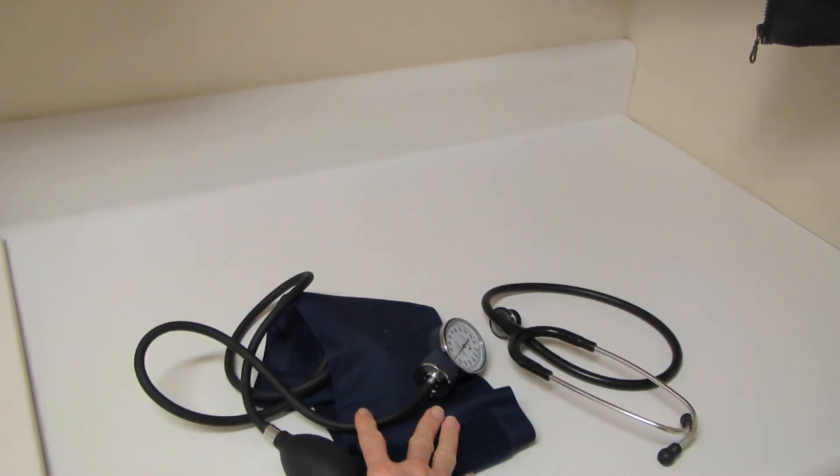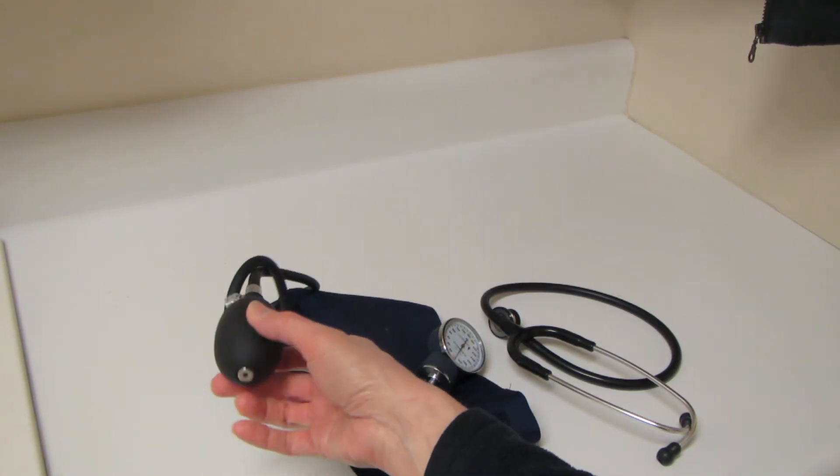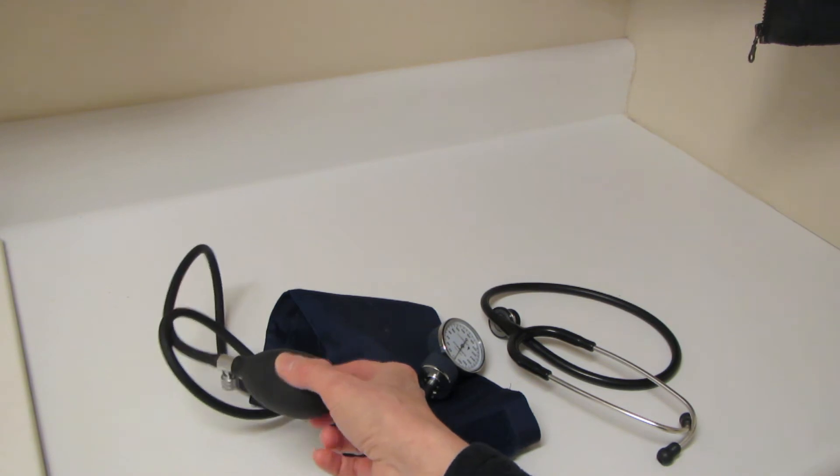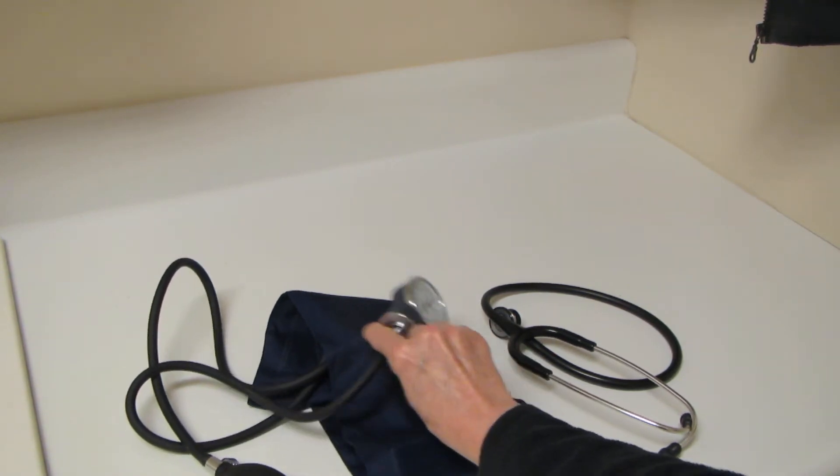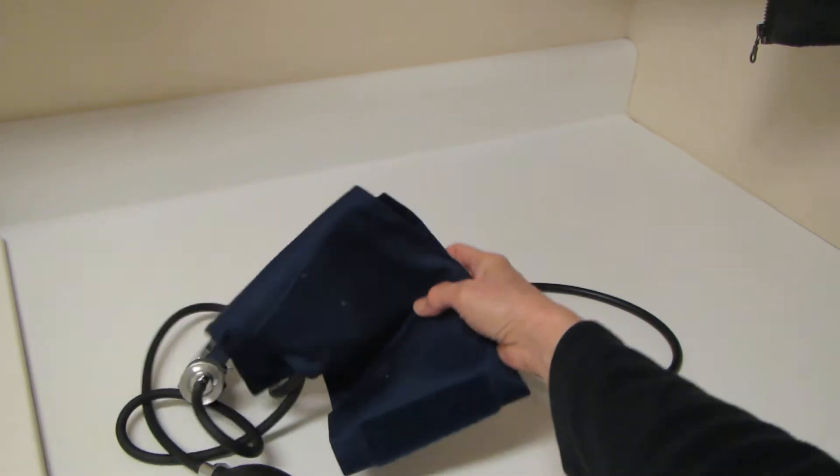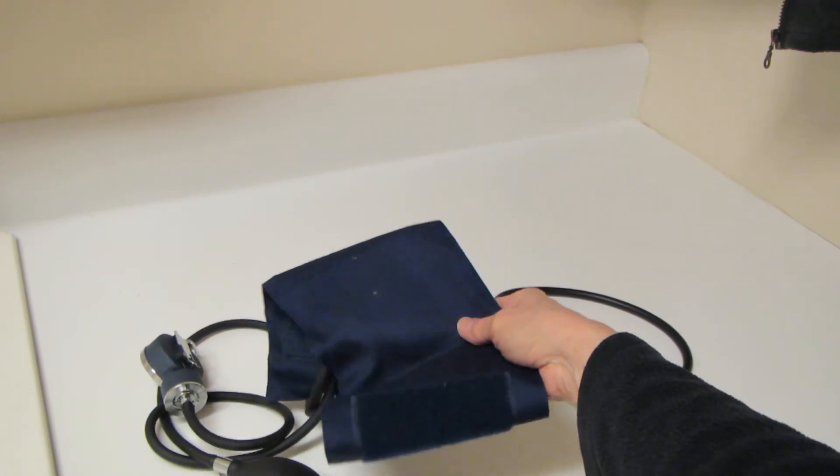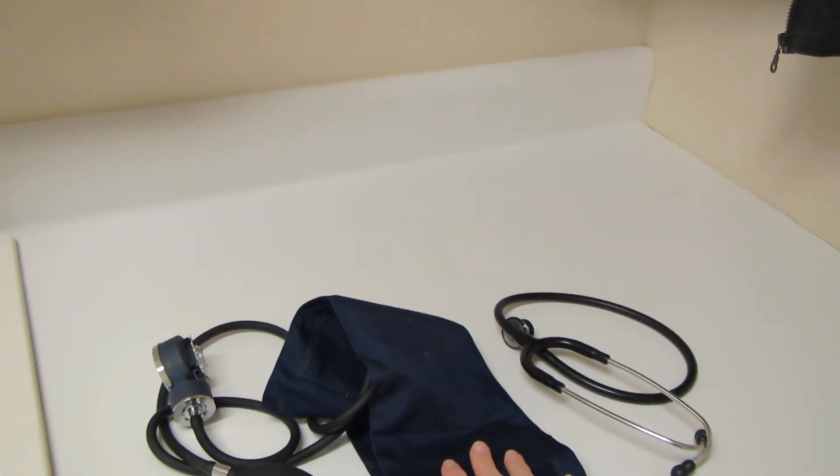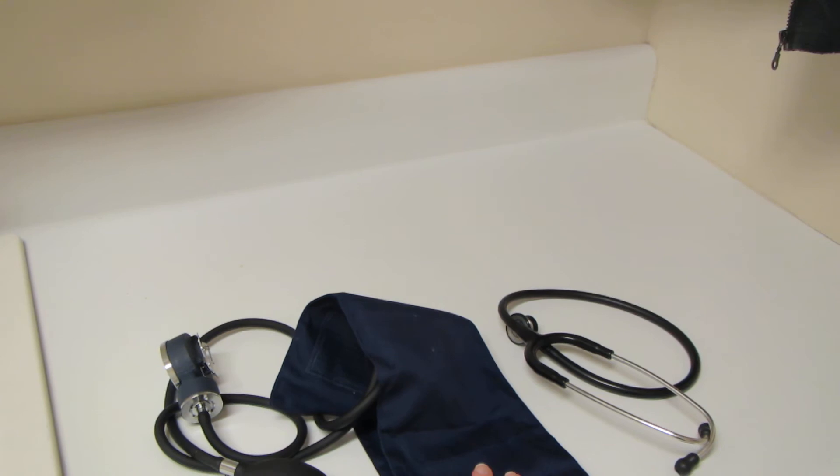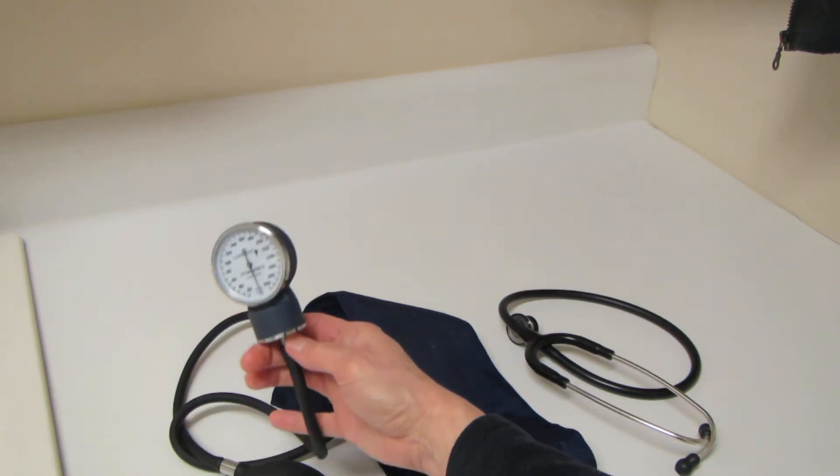So first thing we have here is the instrument itself. It's composed of three different pieces. We've got a bulb that's used to pump air into this cuff over here. The cuff is what fits across the patient's arm, and we always want to make sure we're above, or superior to, or proximal to the bend in the elbow.